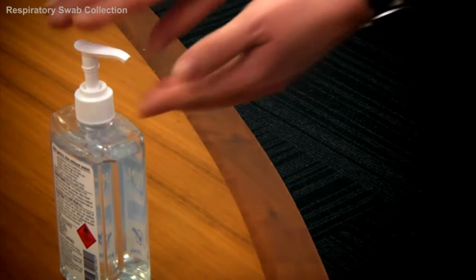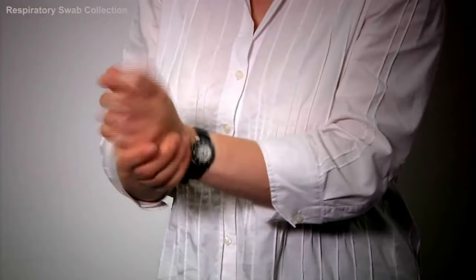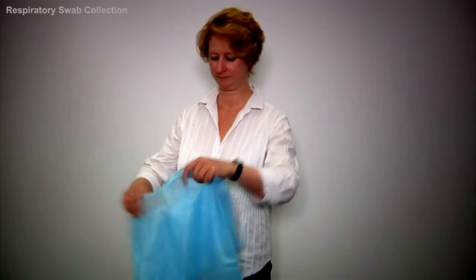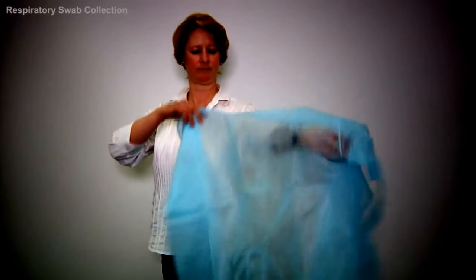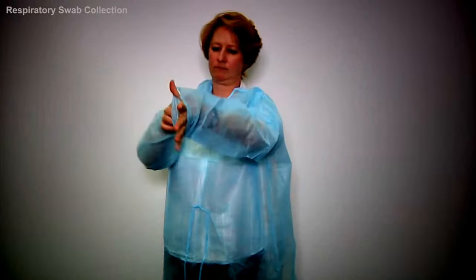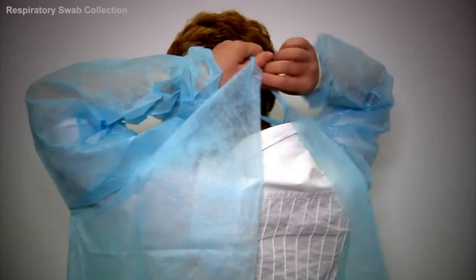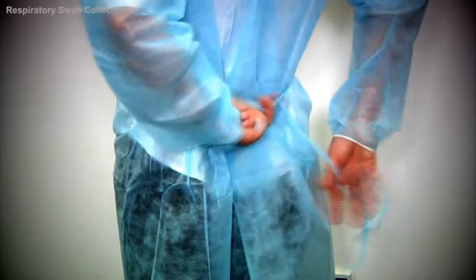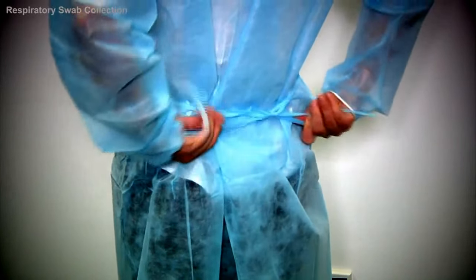Firstly, wash your hands as referred to in the NSW Department of Health hand hygiene policy. Then, place the gown on — place your hands through the sleeves, then secure the top of the gown behind you. To secure the middle of the gown, make sure the ties are placed in a position where you can easily untie them when removing the personal protective equipment.